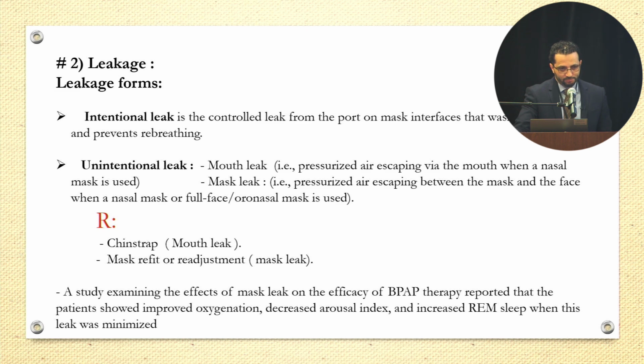How do you fix those? For a mouth leak, obviously you put a chin strap around it so the patient will keep his mouth closed during the nasal mask. Just keep in mind that when you use the nasal mask, the higher pressure causes significant leak. Especially with nasal pillows, you'll face some problems when your patients require a higher pressure. Mask refit or readjustment is used for the mask leak. So try to fit your patient to the best mask possible.